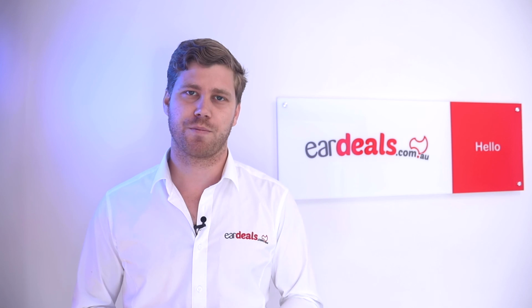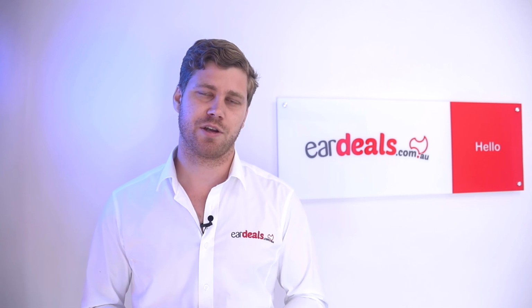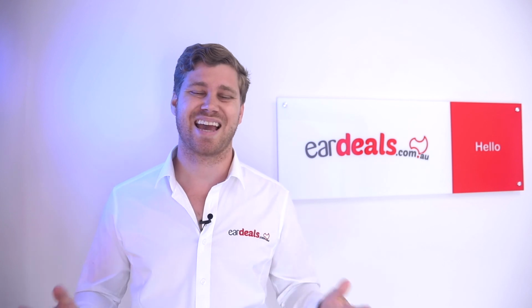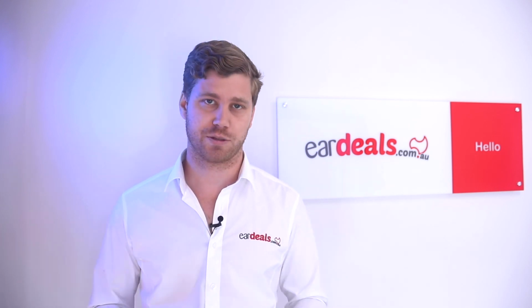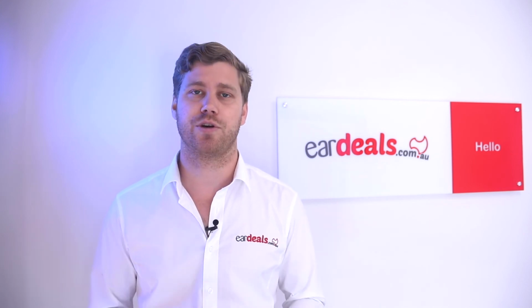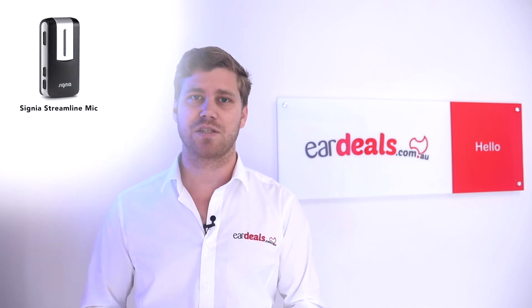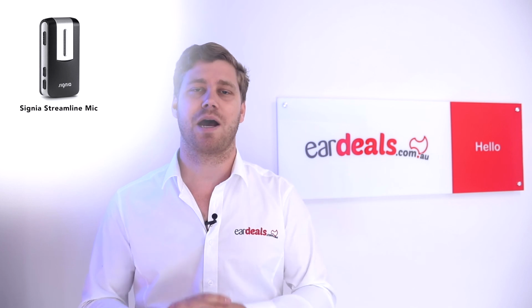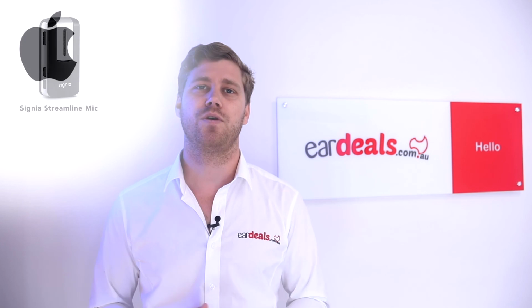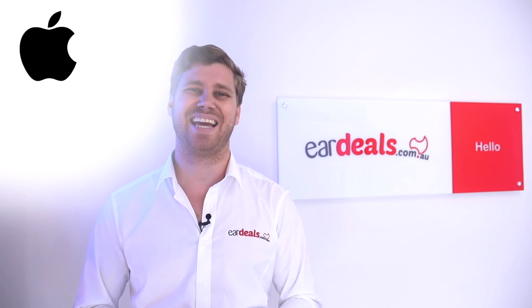It's hard to be critical of the Pure Charge Go X in the sense that it's been a flagship device within the Signia range for many years and is arguably one of the first devices within its category that took on the capabilities of rechargeability. However, one key component that needs to be considered is around Bluetooth. Those that have Android devices do require an additional device to be able to link to that hearing aid, which comes at an additional cost, and that's called the Streamline mic. For those of you who have Apple devices, it's made for iPhones, so connectivity will be seamless and easy to use.